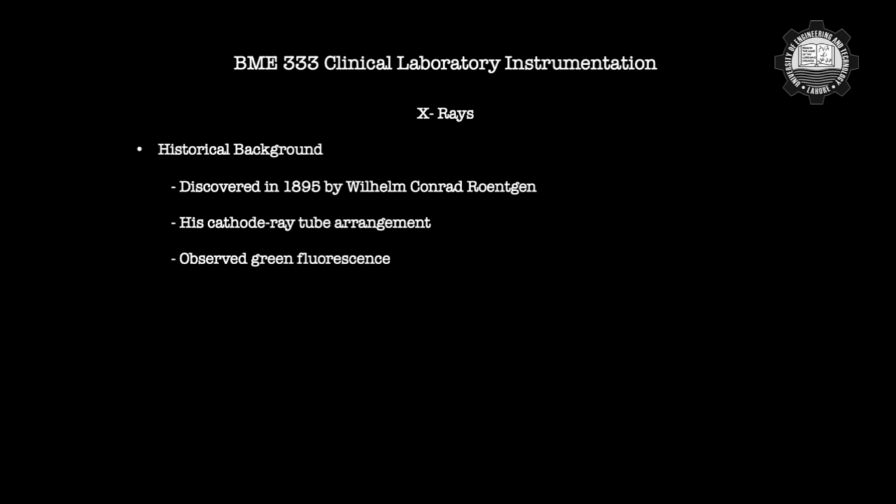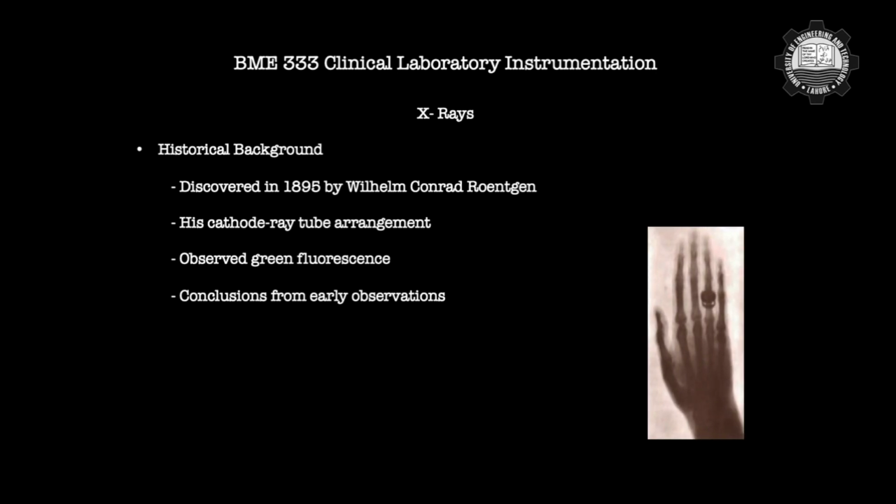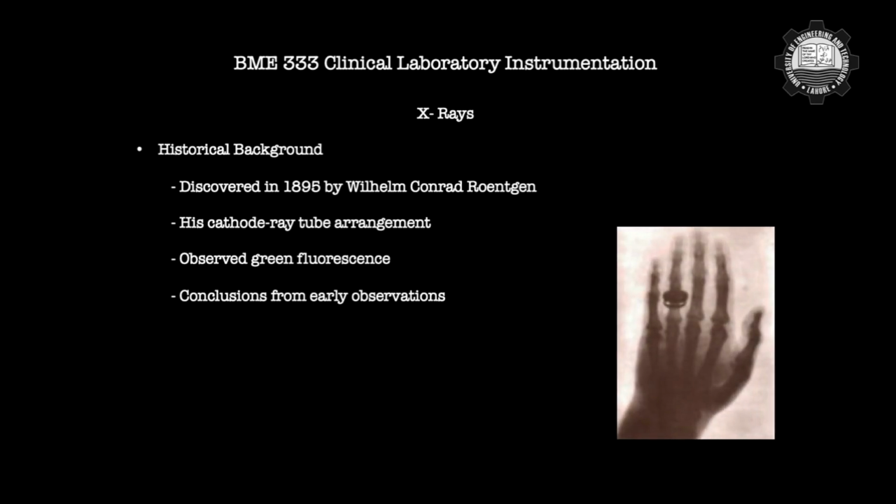One of the famous experiments, or the famous X-ray films that he developed, was of his wife's hand, which is pretty famous in historic context. He X-rayed his wife's hand, and as you can see, there's a ring on the finger as well. The bones and the metallic ring tend to appear as dense structures, which is why X-rays would not pass through them, whereas the soft tissues around the bones in the finger would allow the X-rays to pass through them.